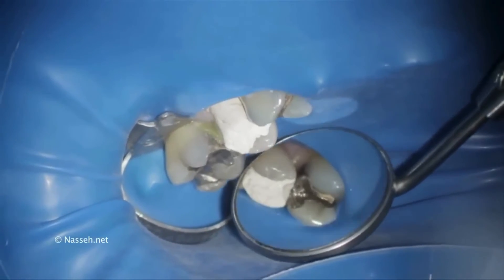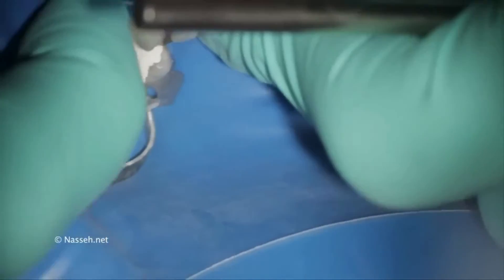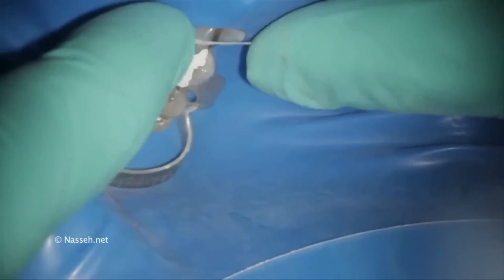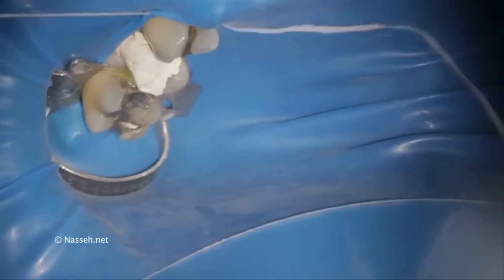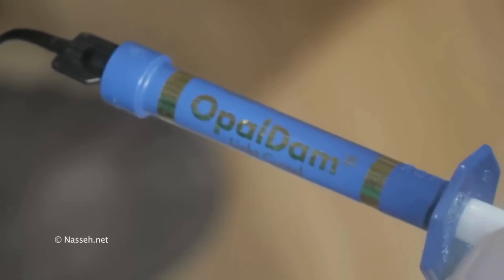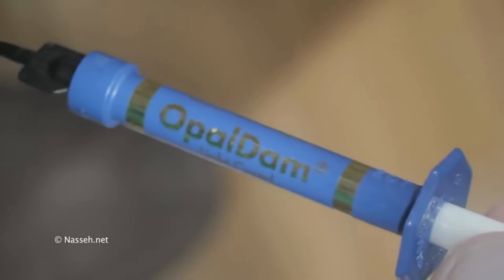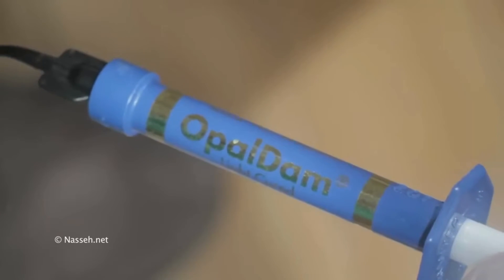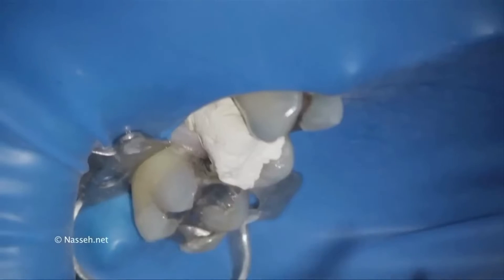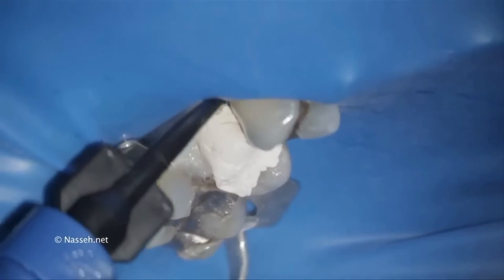Generally, running the rubber dam through the contact area may be enough; however, passing a floss through will secure the rubber dam better. You could also use widgets — a thicker type of rubbery floss that keeps the rubber dam in place. There is also a product by Ultradent called Opal Dam, which is essentially a light-cured resin applied to the area.